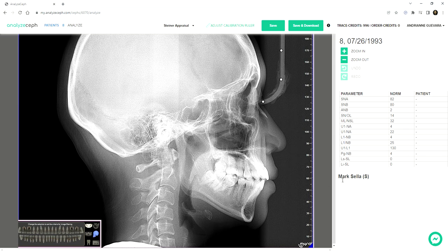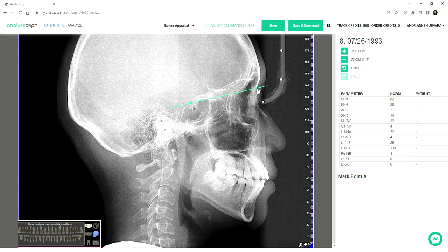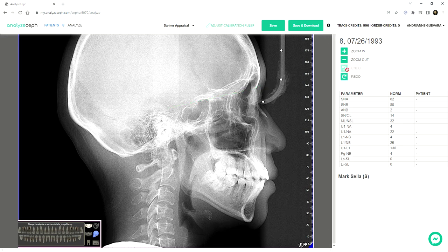Let's follow the instructions. Mark Sella, mark Nasion. If you see the mouse pointer — the finger pointing on top of a plotted point — it means you can actually move it. You can change the position for correction. Or if you want to go back to the previous point and you're simply confused, you can undo your work, and you can also redo.